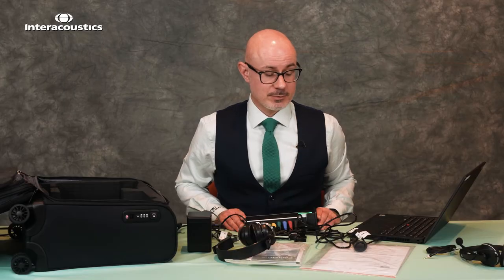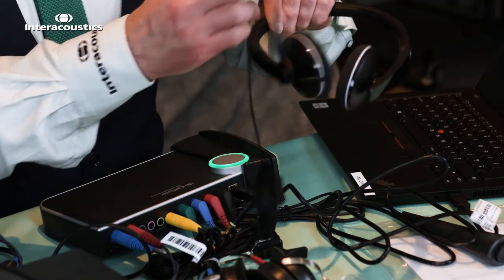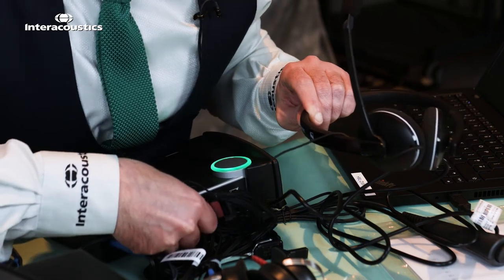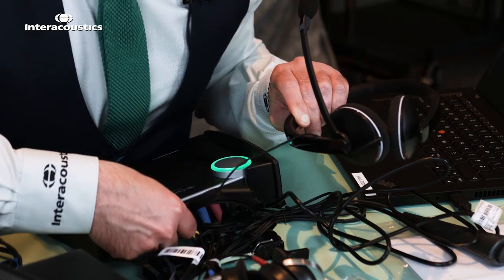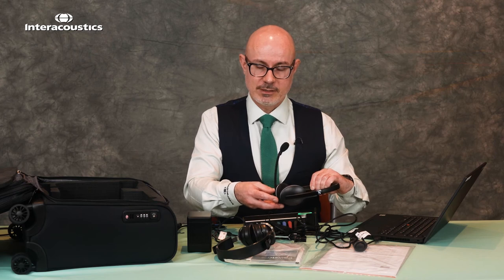For installations where the patient may be at a distance from you or in a booth, we can use the monitor headset. We place the green jack into the monitor slot, and using the boom mic we can use the talk forward facility by placing the jack into the pink port — then you're ready for your testing.